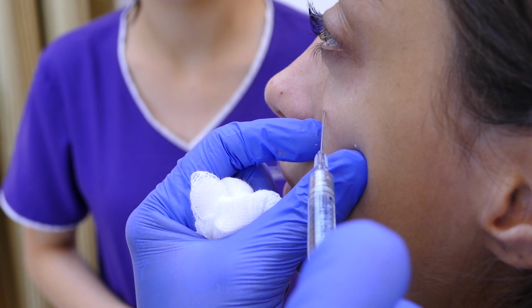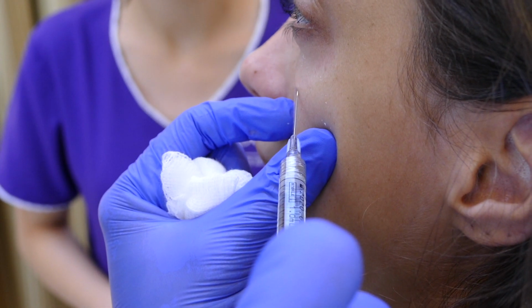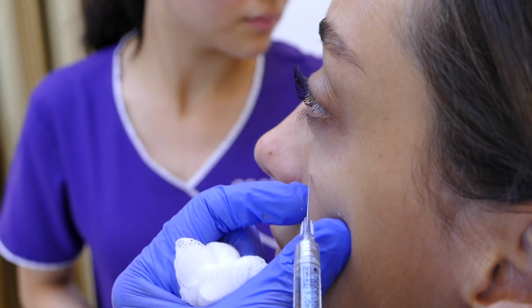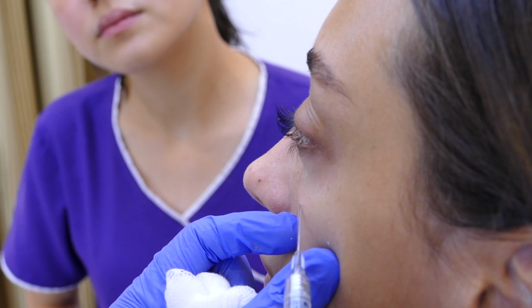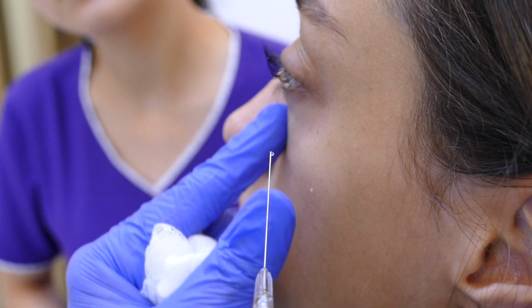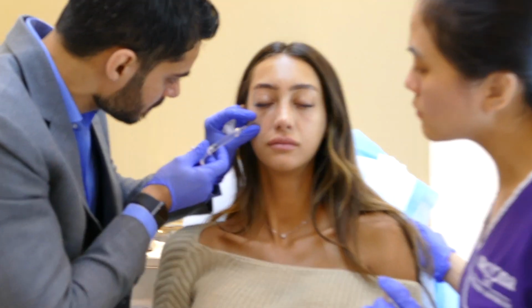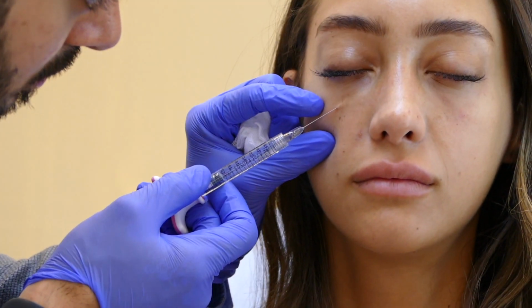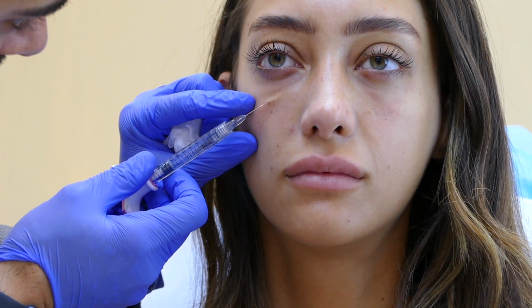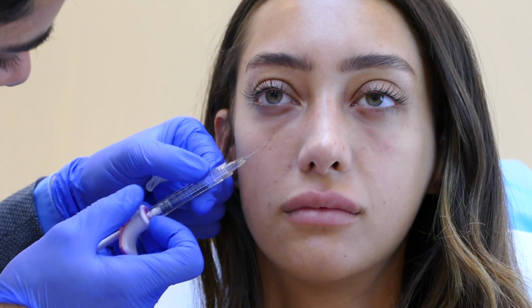This is another angle to show the direction of the cannula, which is towards the medial part of the infraorbital rim. The cannula insertion needs to be very gentle with a gentle wriggle, avoiding any thrusting movement. Other side, a close-up view to show the direction of the cannula, penetration of the cannula, negotiation underneath the muscle, and then tiny aliquots of filler are placed as you withdraw the cannula.